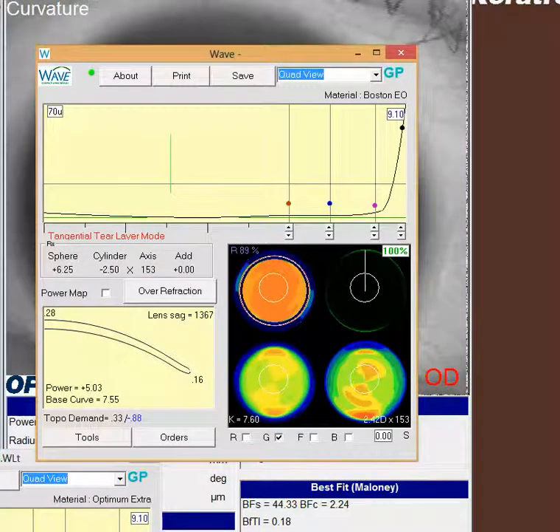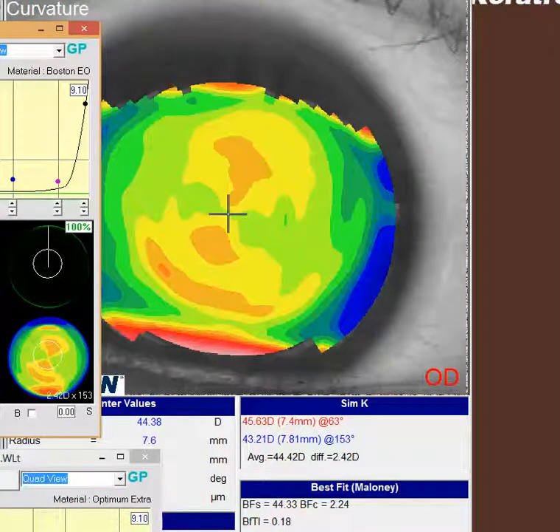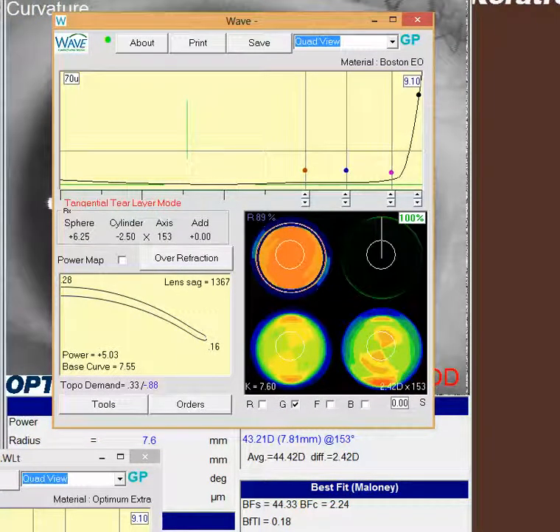If you remember, this right here is what Wave deciphers from the corneal topography. So you can see when I did not average it, I got a very nice close representation there. And I chose to go with a G-SIM design, try to get some back surface toricity on that lens. And by doing that, you get a lens that very nicely matches in all meridians here.